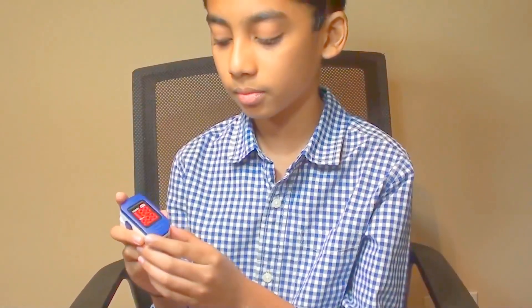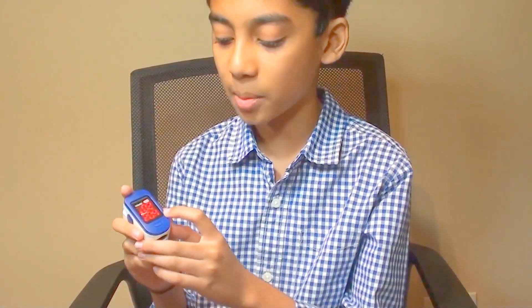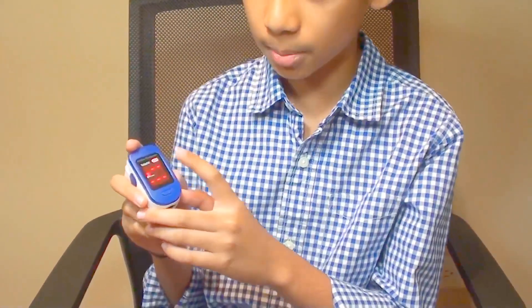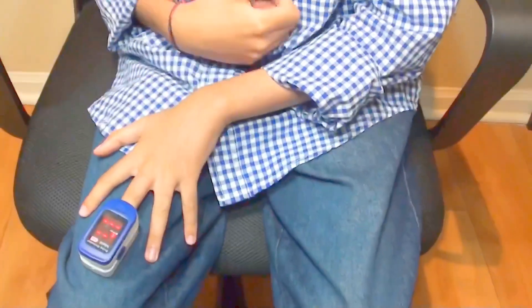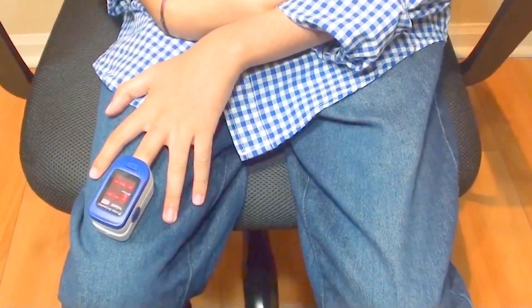Now I'll show you a demonstration. See here, this is the pulse oximeter. Just turn it on — then it should be blank. It's blank. Then open this and put your finger inside, then rest it somewhere.